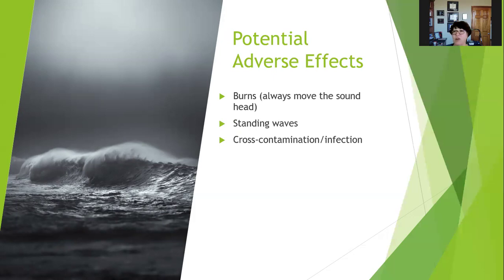In the olden days, we used to keep ultrasound gel just in a warmer in the clinic, and then the infection control people came around and said, nope, nope, nope, you can't do that. You have to have separate, sealed, sterile ultrasound gel applications for each person. So we got these little packets you have to open. So, your mileage may vary. You want to clean your equipment after you use it, obviously.